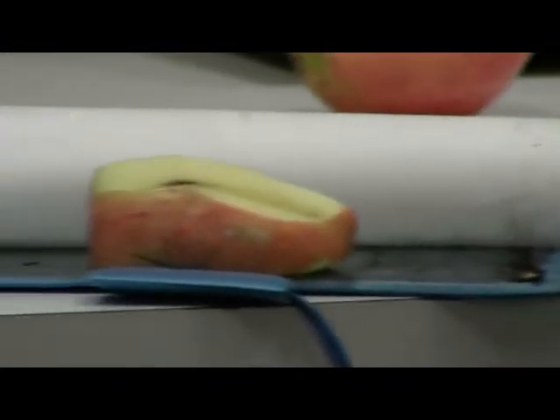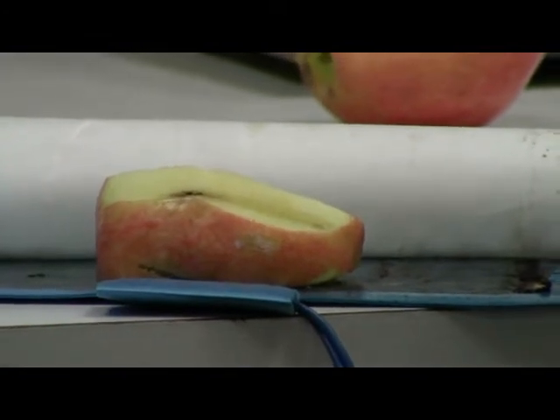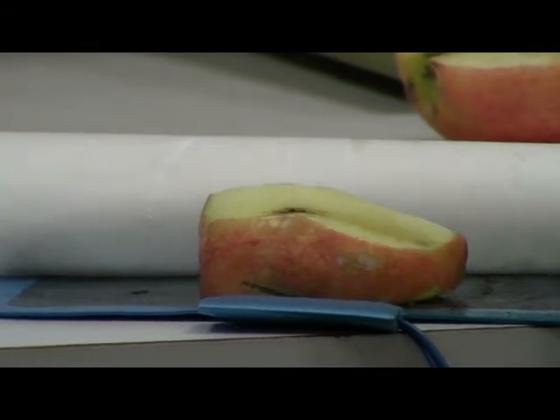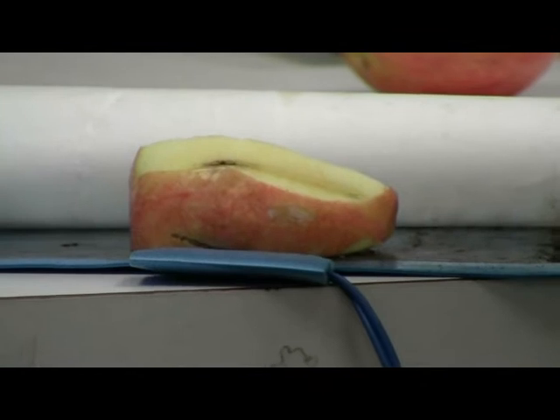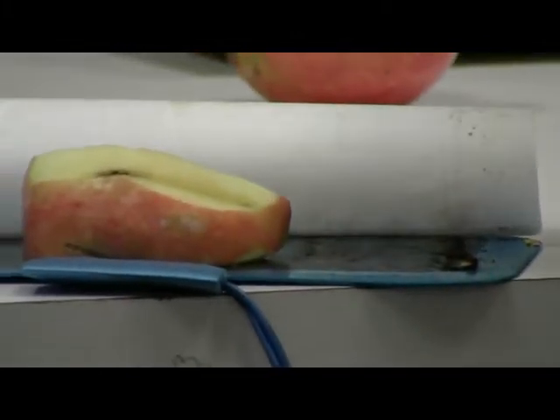If the surgeon gets into an area with a lot of blood vessels and there's a lot of blood, he can switch to the coag mode. That would help coagulate or cauterize the blood vessels to stop the bleeding. So now I'm going to select the foot switch for coag.